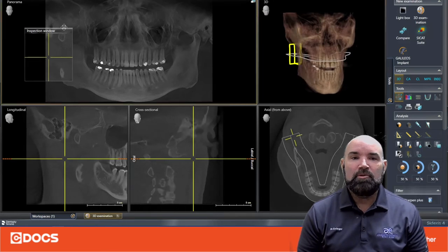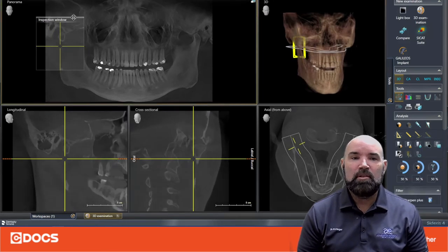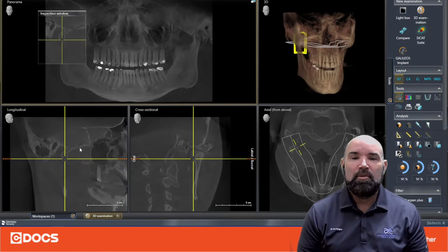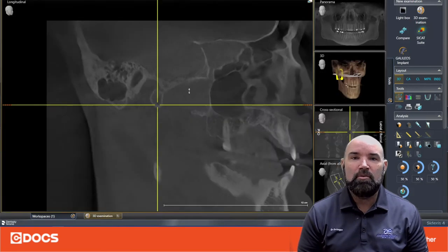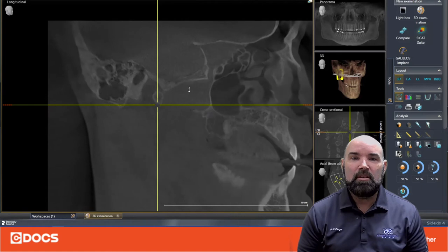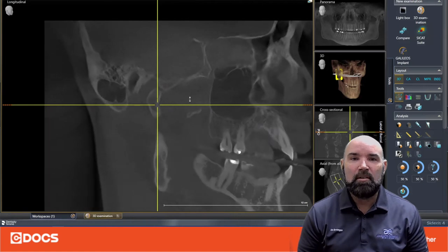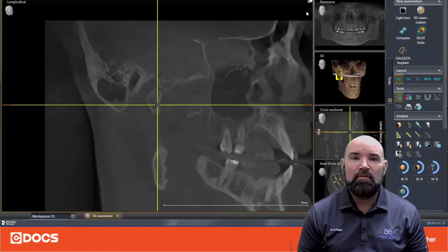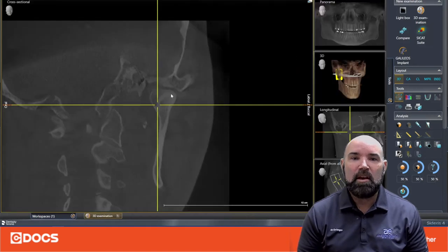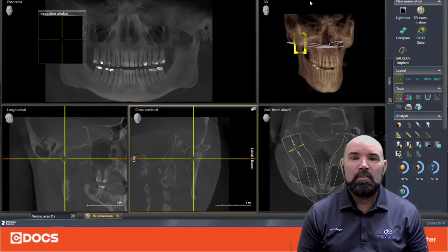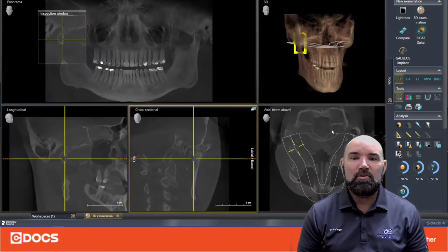What you'll notice with the Axios scan is we've got a large 17 by 13 field of view, which gives us easy access to evaluating our condyles. You can see here on the video that I am zooming in on the condyles, appreciating the cortication to the condyle and the fossa floor and the eminence. We can see that that's all visible.